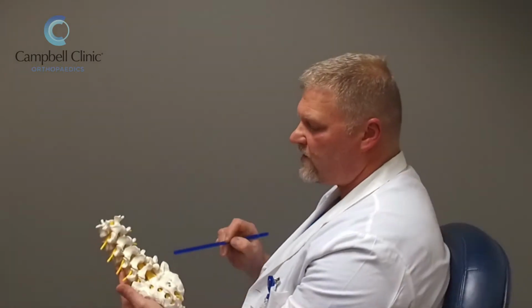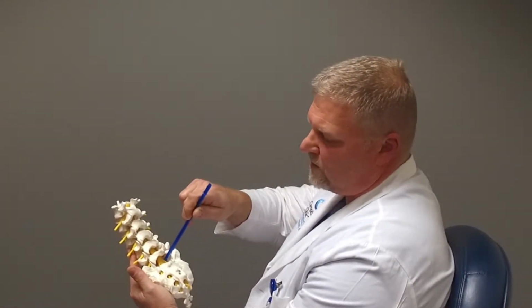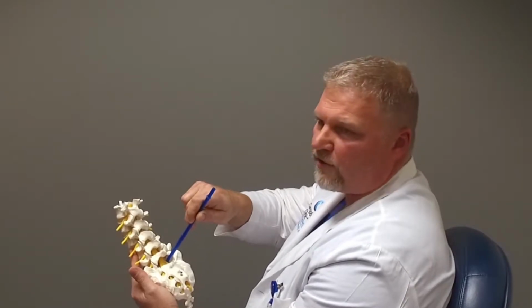So an interlaminar endoscopic discectomy is typically performed at L5-S1 for posterior disc herniation. At L5-S1, the interlaminar window is larger, so there's more room to place the tubular retractor through the interlaminar window. That allows us to remove the offending disc herniation without cutting into the joint or destabilizing the spine.